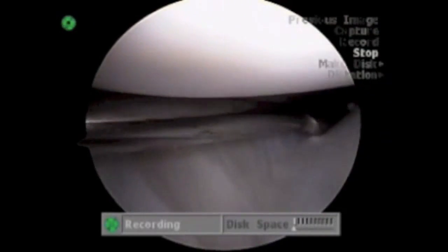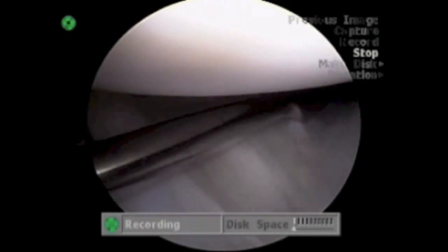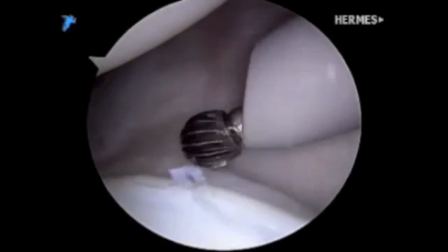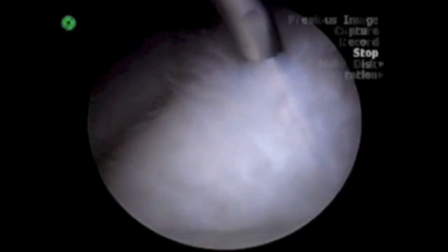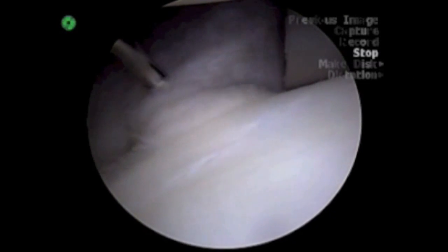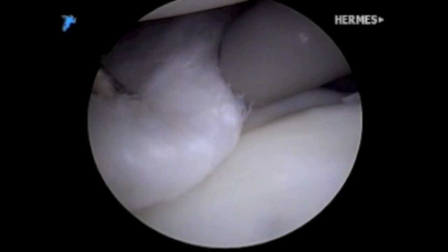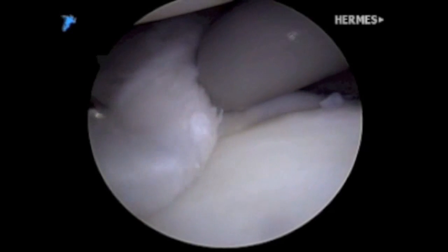Viewing from an anterior superior portal and working through both the anterior and the attenuated capsular tissue, this promotes soft tissue scarring and healing. The primary direction of instability, which is inferior, is a common finding in all symptomatic multidirectional instability cases.